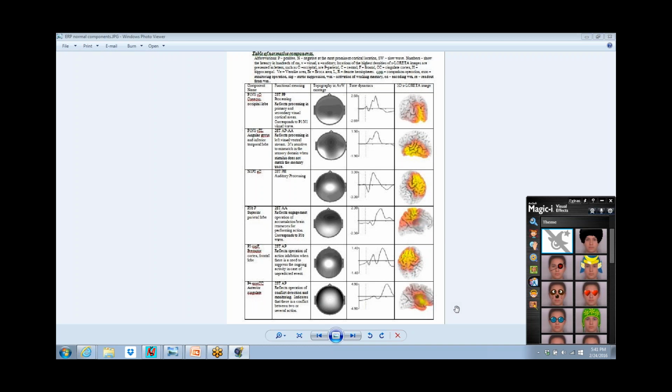I also suggested that not every deviation in a database is an abnormality. Last I knew, a statistician was not the same thing as a therapist. If you get a statistical deviation, you might have an abnormality, and it could really be abnormal, but it could also be a compensatory mechanism. It's not normal to be carrying crutches, but if you got a broken leg, you better have them.